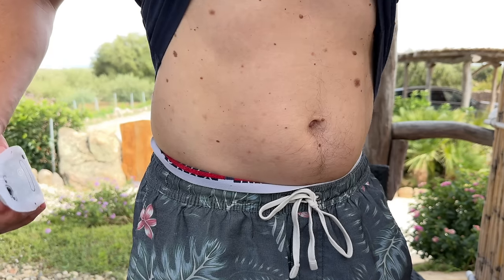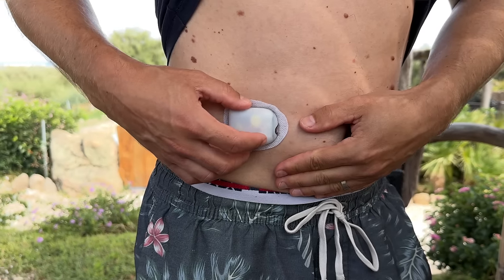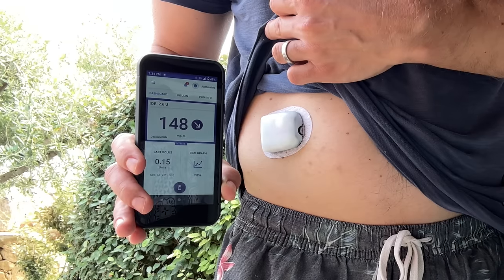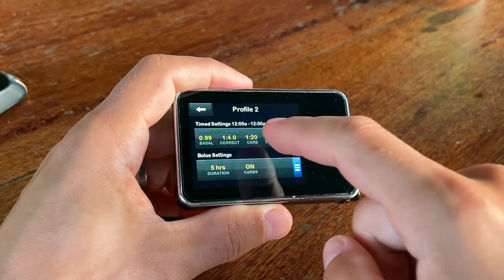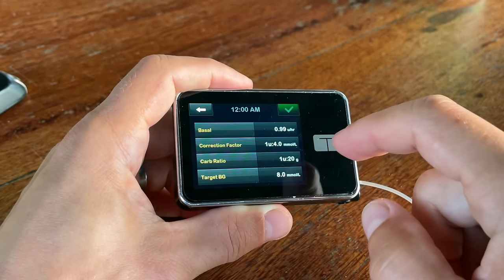Both algorithms are super smart but very different. One key difference is that the Omnipod 5 algorithm is adaptive — every time you put on a new pod it learns about you, and the system gets better with every pod. As your lifestyle changes the system adapts and makes changes to your basal rate automatically. Tandem doesn't have an adaptive algorithm — it uses basal rates you set up manually as a baseline and never adjusts them. If you want to change the baseline basal rates with Tandem, you must do that manually.